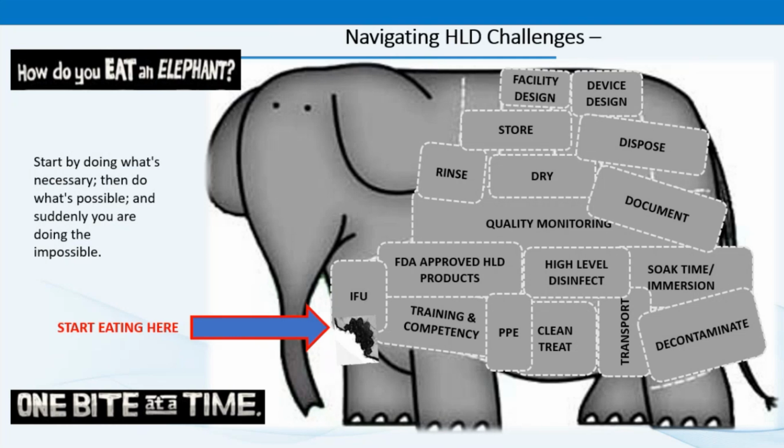Documentation logs are important tools for infection preventionists, department heads, and risk and quality management, and they should be reviewed regularly to identify any gaps or omissions. Then we need to store our device in a separate room from patient care in what would be considered optimal conditions for use on the next patient. So that would be a low traffic, clean, dry, and dust-free place to protect them from damage and contamination. Then we'll dispose of that residual solution according to federal, state, and our local guidelines and regulations.